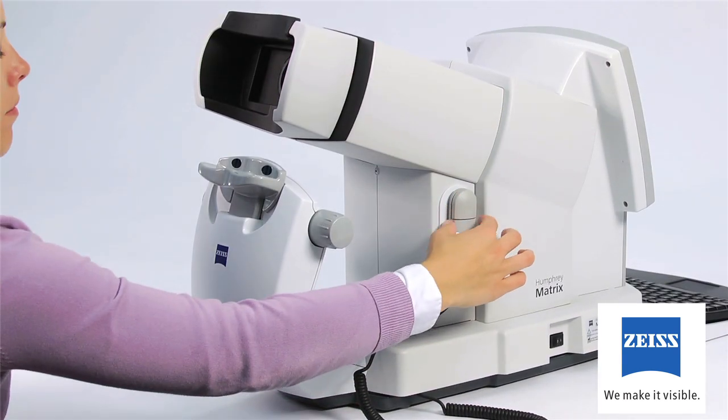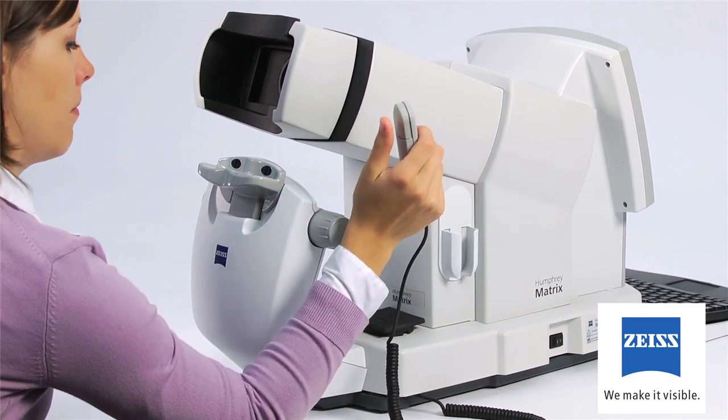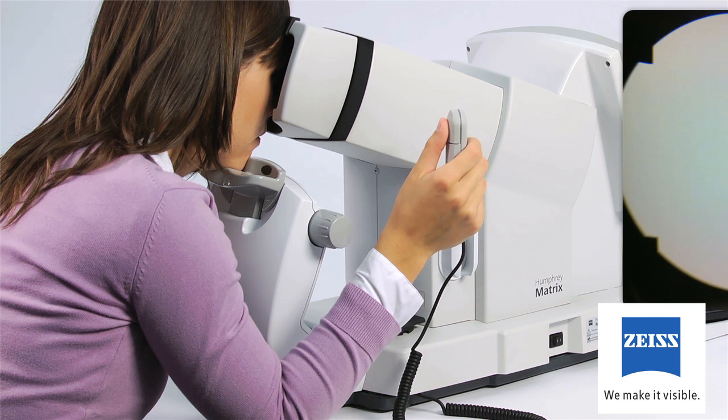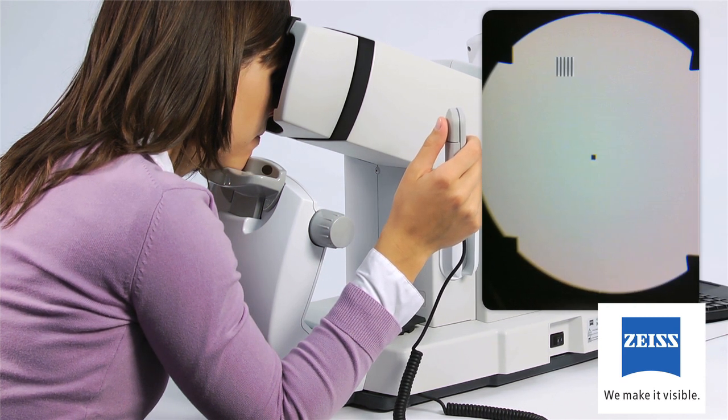Ask your patient to pick up and hold the patient response button, then to place their forehead on the brow rest and look into the eyepiece. Ask your patient to look at or fixate on the black dot in the center of the screen. The black dot may appear blurry to the patient — explain that this is normal. Ensure the patient can see four black points or alignment tabs at the 2, 4, 7, and 10 o'clock locations while looking at the central fixation target.